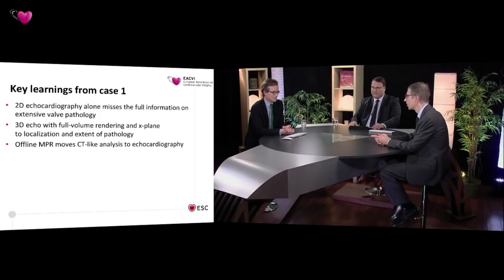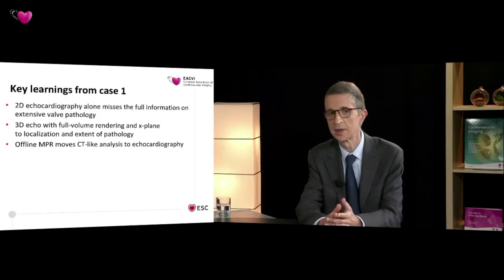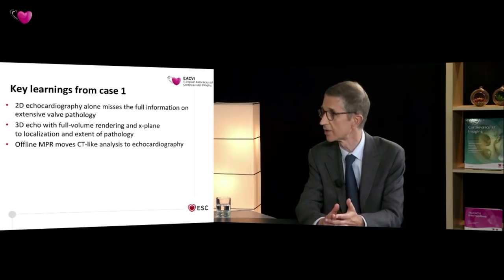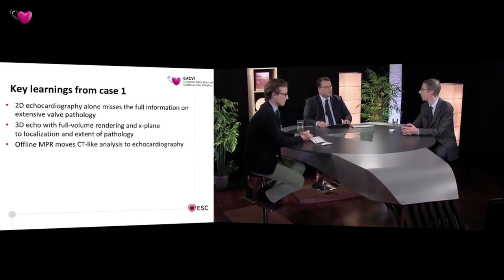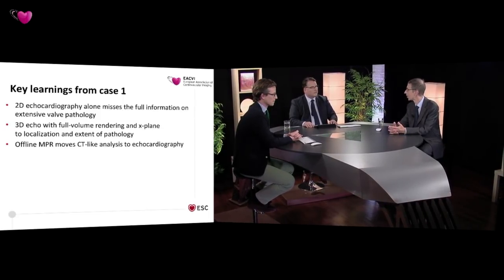Yes, I think for degenerative mitral regurgitation, it is clear that it's a beneficial technique. And in this pathology, often the left ventricular function is normal. And when you correct the mitral regurgitation, you correct the disease. So it is a very good treatment. So in patients who are contraindicated for surgery, it is really a good alternative. For functional and secondary MR, we wait for the other trials.